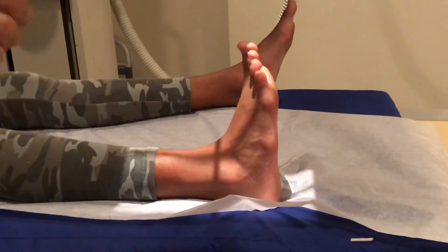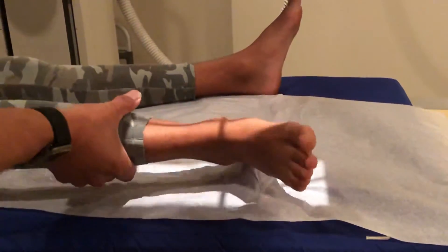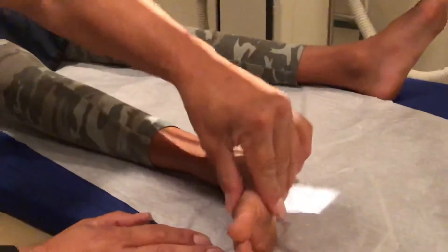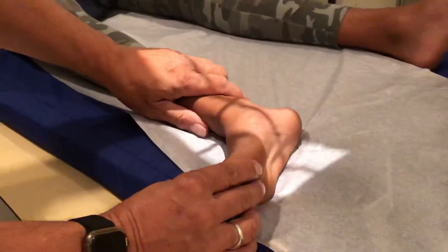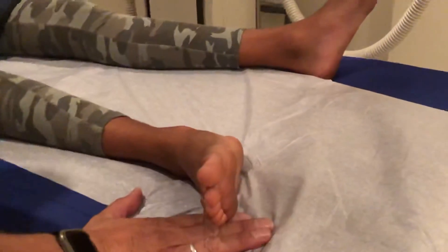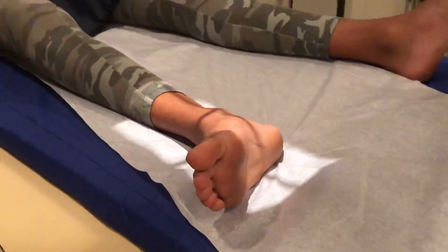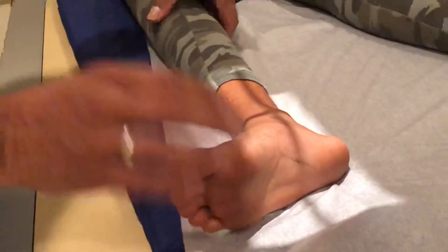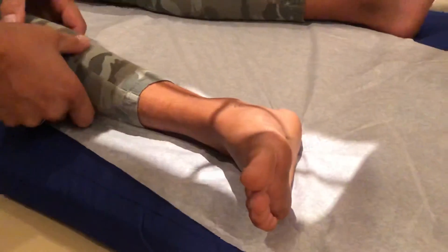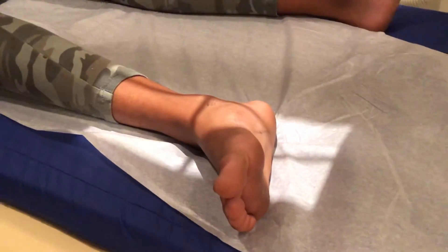The third one is going to be a lateral, and that's just like the foot. We're going to turn the knee out all the way. Ideally, instead of having it totally lateral, we're going to have it almost totally lateral — kind of a relaxed lateral. That's because you want the tibia and the fibula to superimpose on each other. You want the malleoli perpendicular to the table. That's the third view on an ankle series.